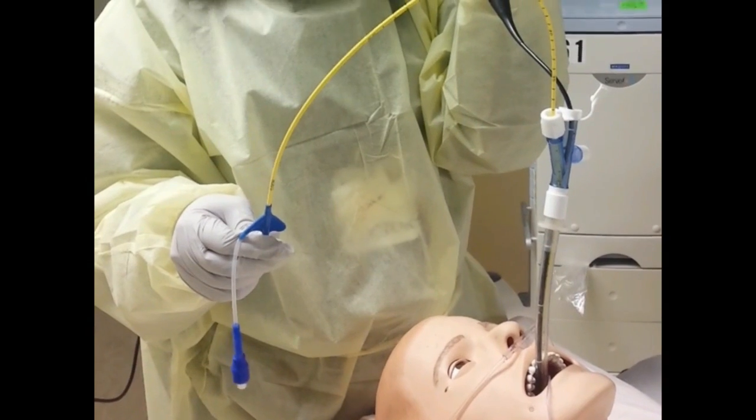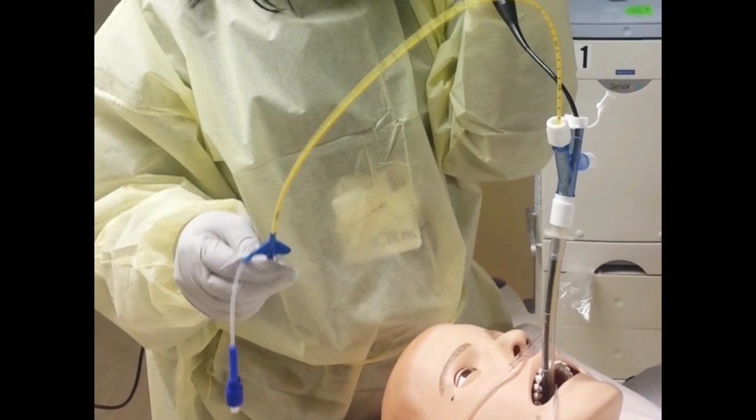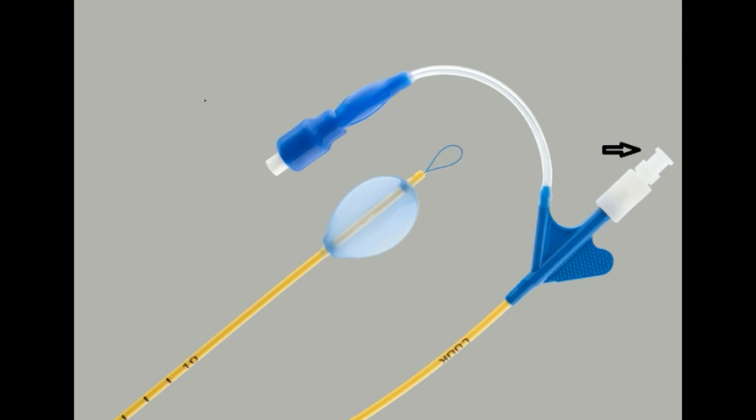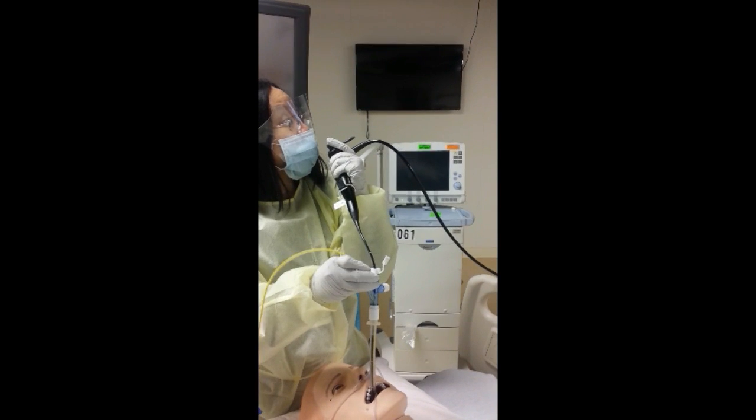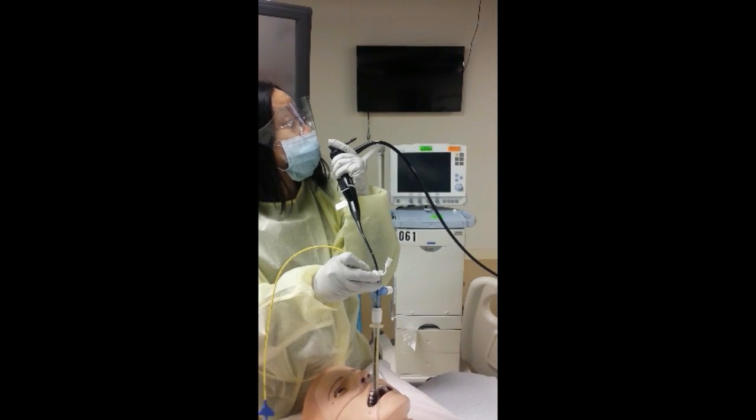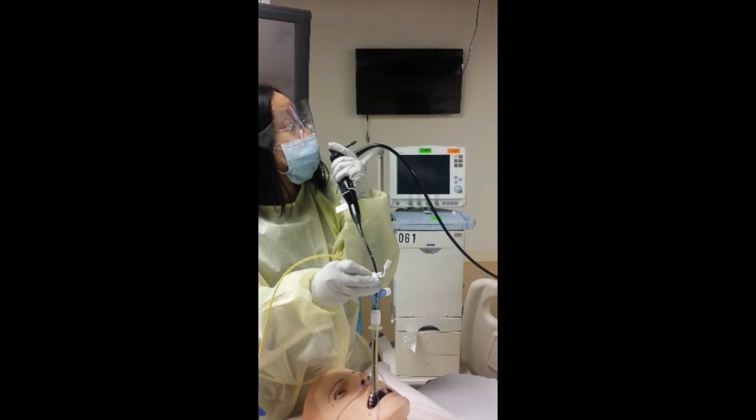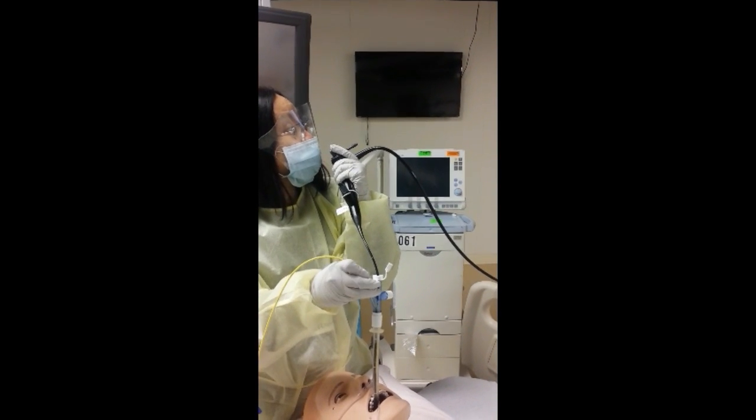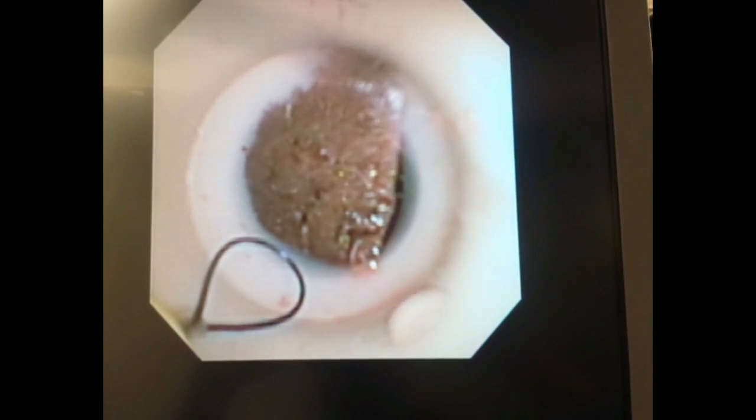Once you have reached the desired location, release the snare by loosening the snare loop proximal end. Then advance the blocker alone so that there is visualization of the snare and the balloon.